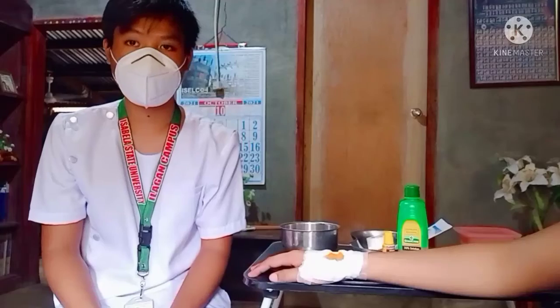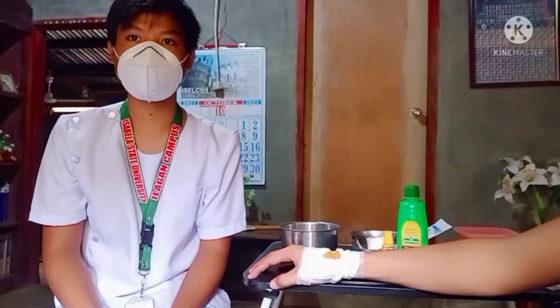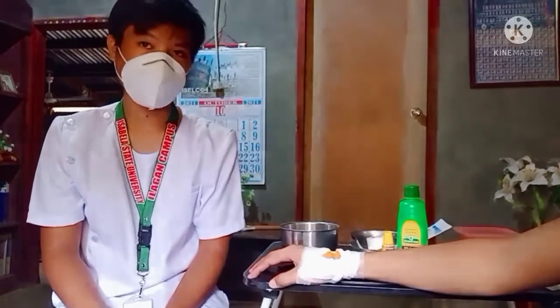Since the wound of the patient is located in the hand of the patient, we assist the client to a comfortable position in which the wound can readily be exposed. And now we're going to perform the second step, which is remove the binders and tape. Remove the binders if used, and place them aside, and untie the tape if used.